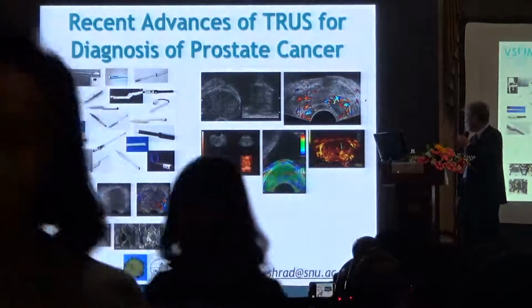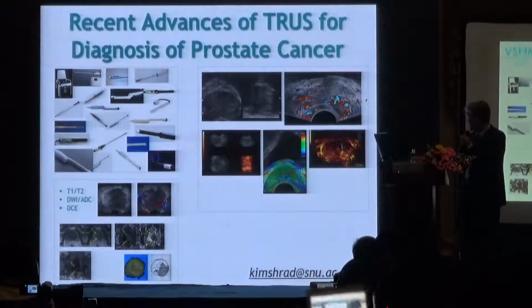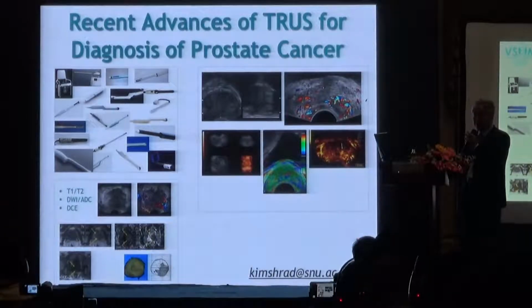And so I would like to summarize my talk on transrectal ultrasound by mentioning that there are a lot of advances in technique, and we can use that technique, and also we can use MRI, and comparing findings is important to improve transrectal ultrasound. And so thank you so much for your kind attention today.